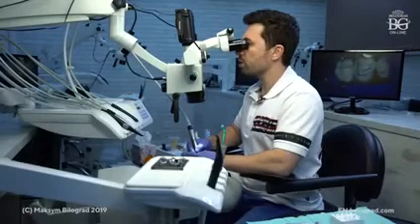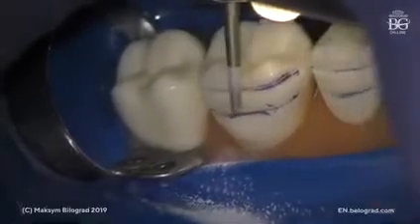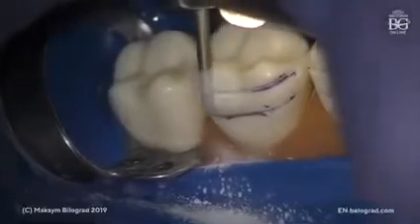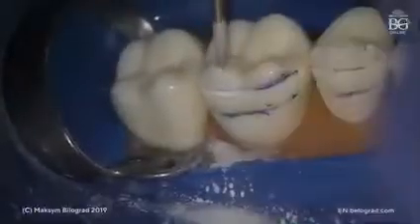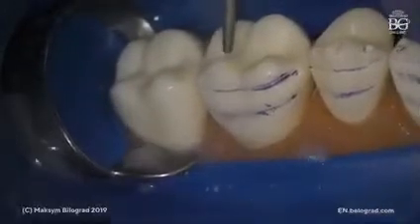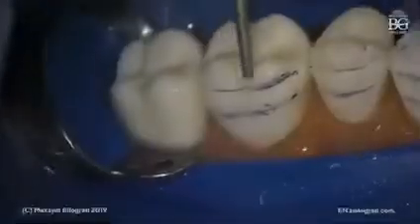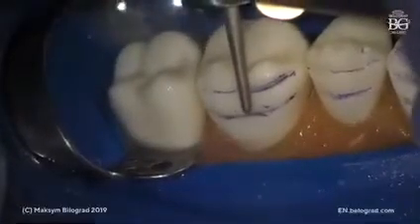So here I just go to incisal plane, let's say. Let's assume this is incisal plane, and I would prepare until I need a little bit more water. In a real patient case, we'll use a lot of water during this stage because the speed is pretty high, and I don't want to overheat the tooth.